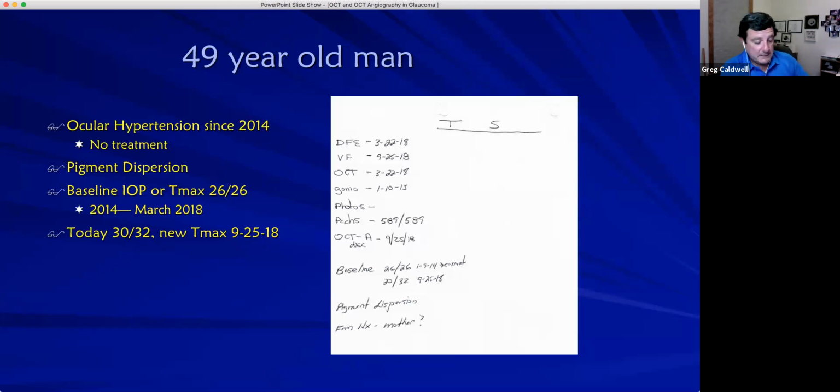But you can come up with a charge. We have a charge in our office, and we just created a 9999 code, and we charge what we feel is appropriate. I believe in our practice it's $35 or $40. I sit as the third-party chair for POA, and people always get concerned when you start dropping numbers. There are over 100 people on this webinar tonight, and I'm not telling anyone how to bill. I'm telling you what we bill, and we don't give this service away. This technology is important, especially in diabetes and macular degeneration, and now in glaucoma. So there's no CPT code for OCTA, a long drawn-out story. We created a code and we can charge for it.